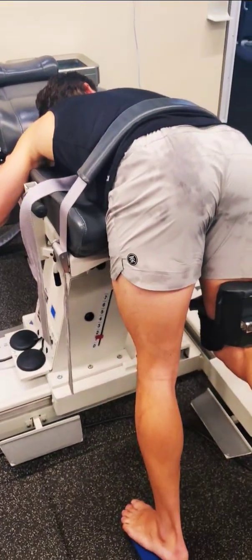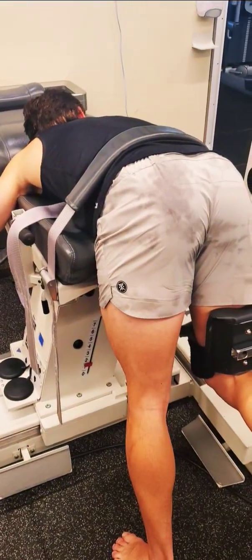And that is the setup for the patient on the isokinetic hip extension.